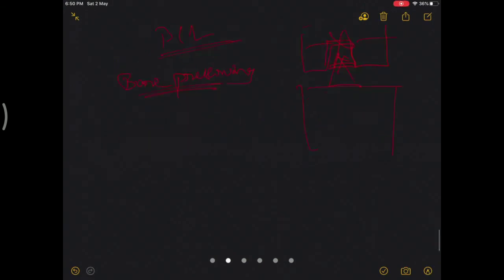And the second thing is you have a natural PCL, which will have a more natural femoral rollback, and it is seen that the gait of postoperative CR knees is symmetric, like that of normal knees. It has a more symmetric gait pattern.